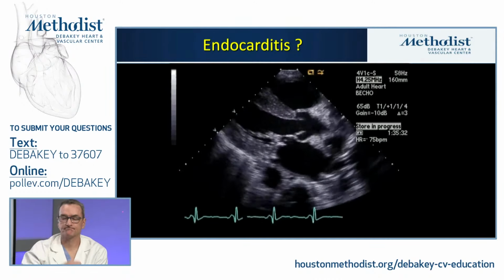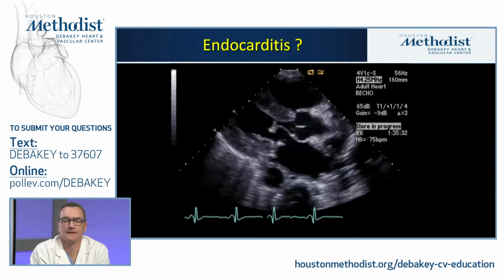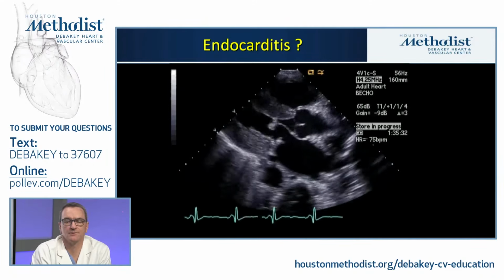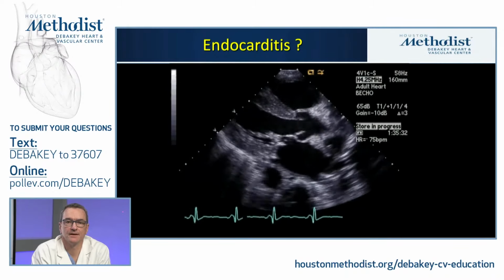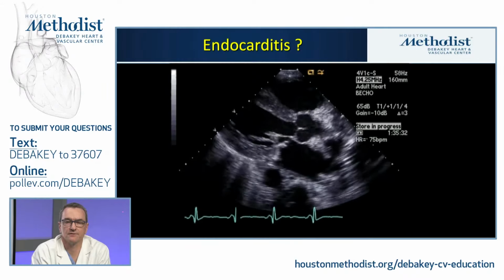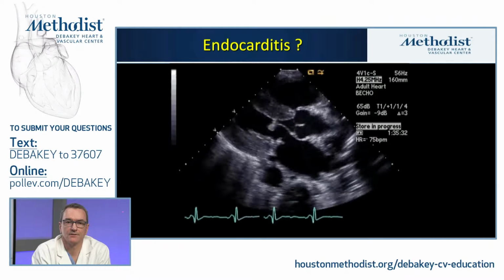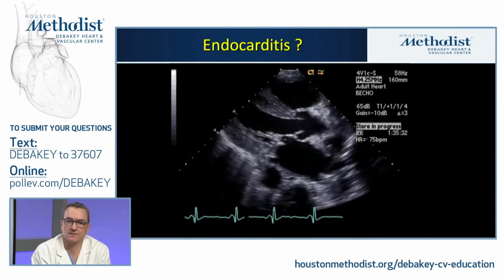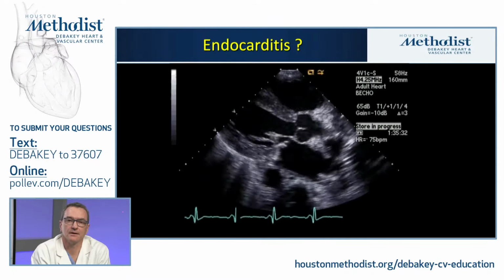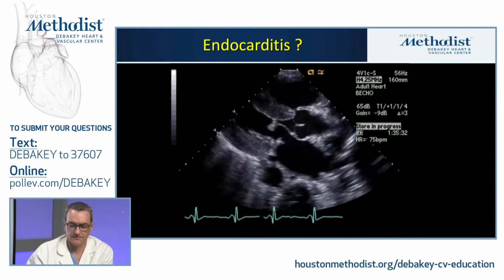So this is an important slide to show you because this is a transthoracic echo, clearly an abnormal mitral valve. You see some diffuse thickening on the posterior leaflet, not particularly mobile. And you see a very discrete hammer-like lesion on the distal portion of the anterior leaflet. If you look closely at this, I would say you do not easily demonstrate oscillation of this mass. It looks very rhythmic with the motion of the valve. So this is the exception to the rule, and this is fungus.